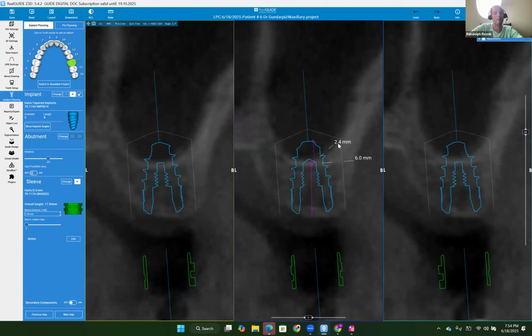Now for an SA3, that's where we're placing the implant and doing sinus augmentation. For this case, you can either do it crestally or laterally. This case is going to be a good one to do crestally, so you're not going to have to do a lateral wall in this case. I would do it via osteotomes where you're going to prep just short there, and then you'll bump that membrane up, put a little bone graft in there to consolidate around it there.